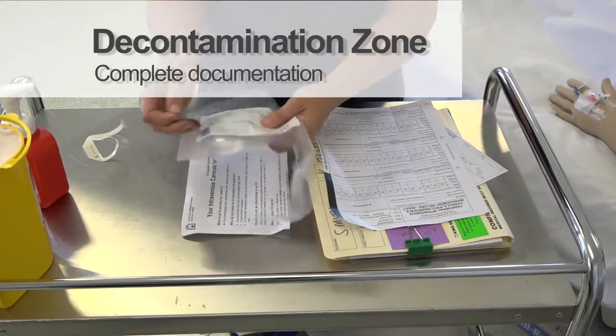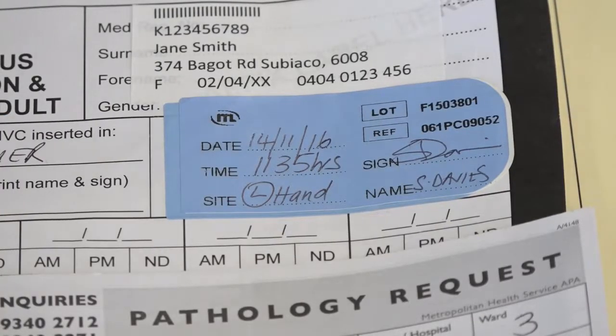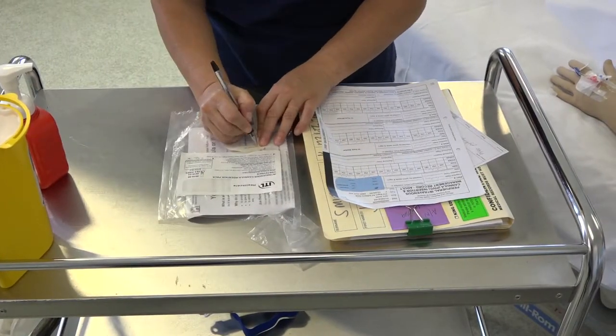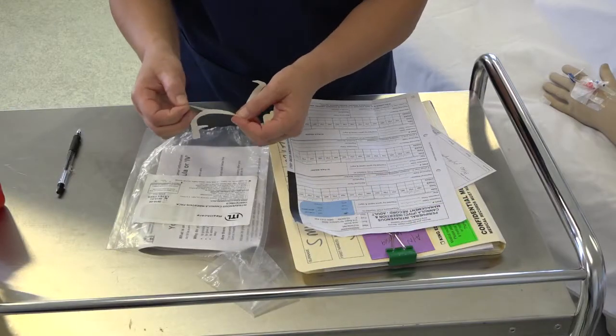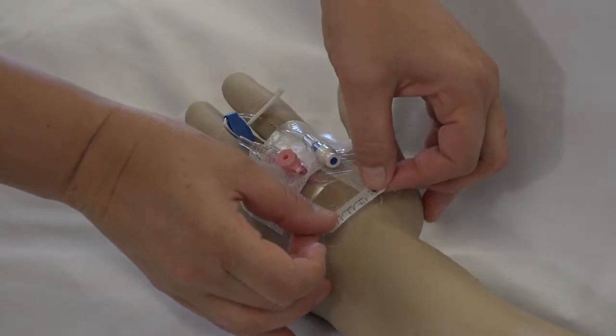Place the label from the packaging on the PIVC insertion and management form. Complete the necessary details, noting the date, time and signature, and place on the cannula dressing.